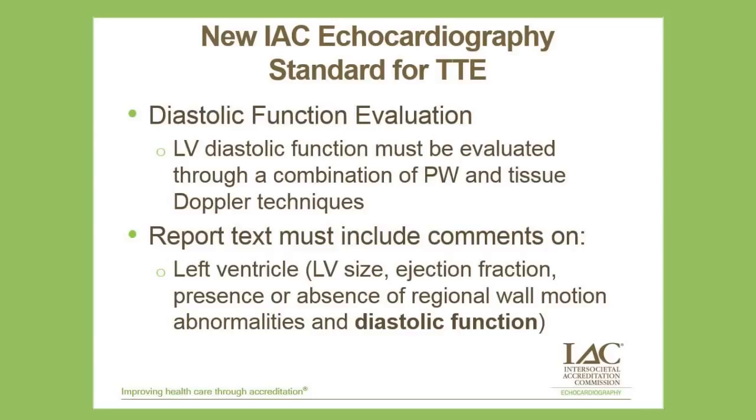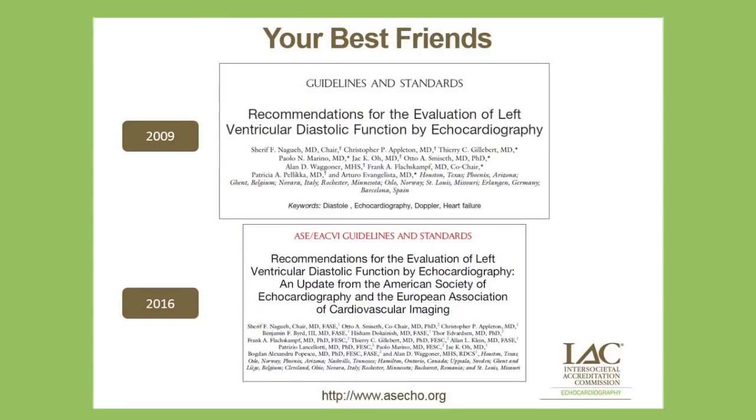And near the end of this webinar, we'll talk about how to report diastolic function, as well as spending the bulk of this webinar talking about how to evaluate it. So, your new best friends. We have a couple of diastolic function guidelines that ASE has published, and I find them very, very helpful both in my practice as well as when I'm teaching.